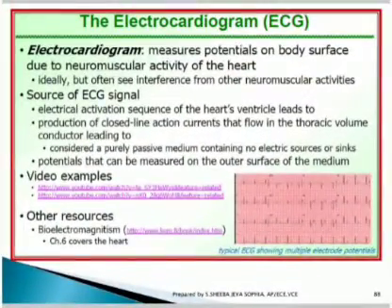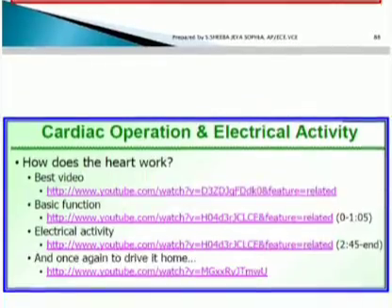Moving to the electrocardiogram, ECG, one of the major measurements, which measures the potential on the body surface due to the activity of the heart. The source of the ECG signal is the sinoatrial node, SA node, the node where the heart pulse originates and is generated.